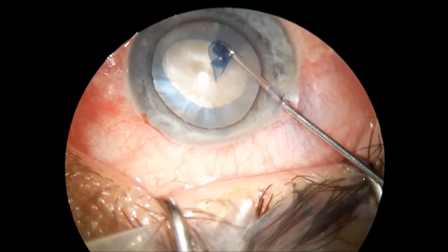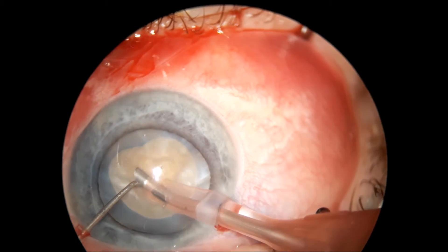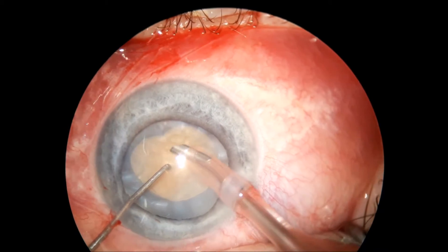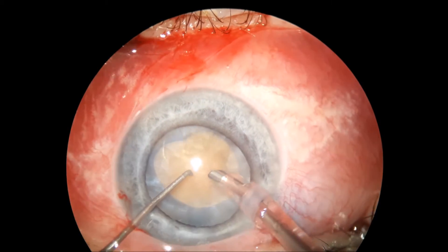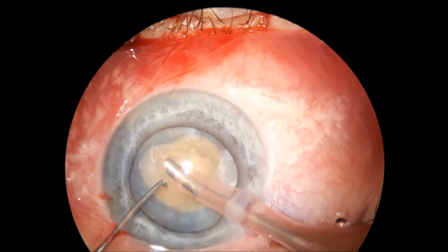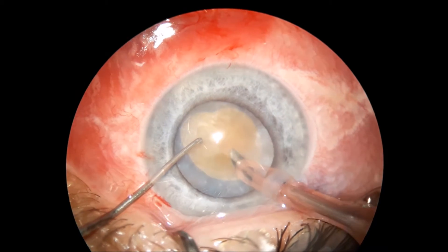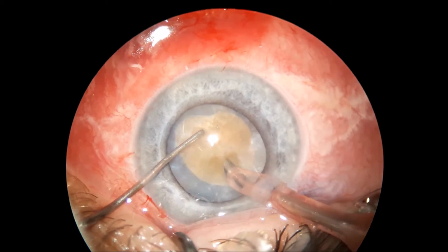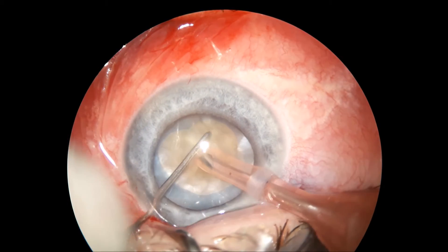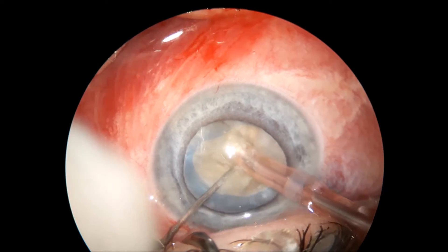The intraocular pressure is very high and I am trying to decrease that by aspirating as much as possible the cortex on top of the nucleus. Then I will do a multiple split chop, trying to make a trench large enough to be able to bury the phaco tip right in the middle of the nucleus. Then I do a couple of chops and have this leathery nucleus separated into a couple of pieces.